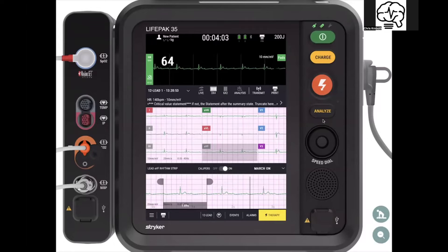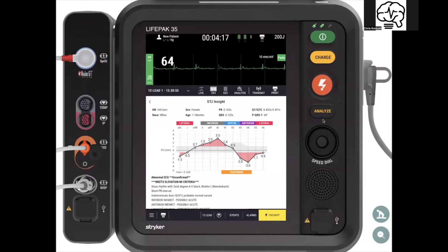So we have the dynamic ECG, the 15-lead with the extra add-on three-lead bundle, labeling of the leads, and calipers. Now let's go to the analysis.